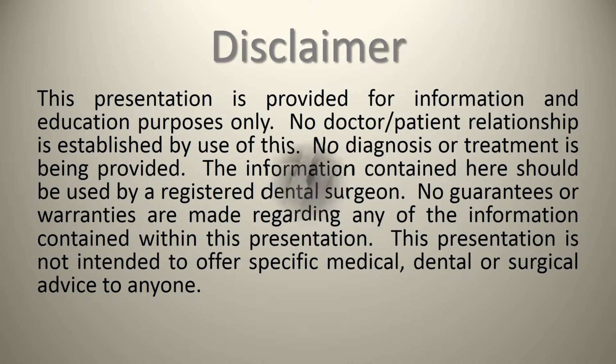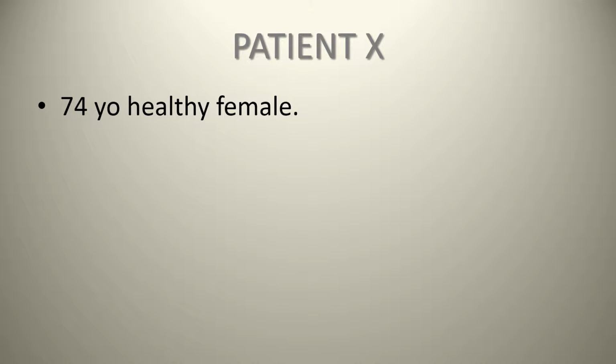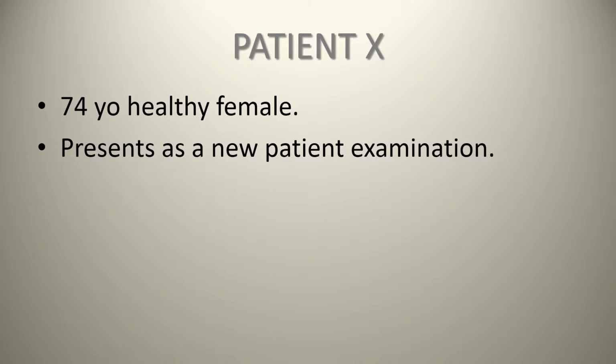So we have a case presentation today about taking an open tray fixture level impression of a dental implant. So we'll start off with a description of our case. We have patient X, who is a 74-year-old healthy female who presented as a new patient exam at our office, and she presented with no chief complaint or no concerns.